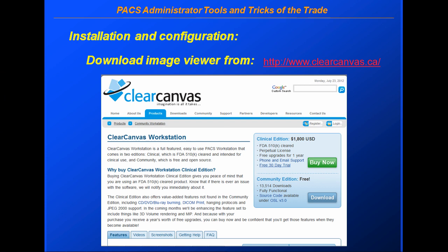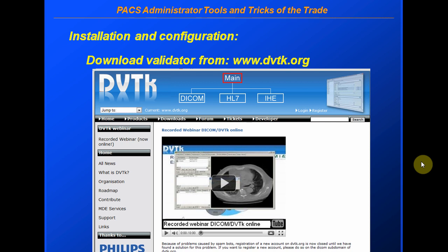The tool we're going to use for looking at the image header is called ClearCanvas. It's an open source product you can download from clearcanvas.ca — it's built in Canada, a very nice utility, and you can download the free version at no cost. The next tool we'll download is the DICOM validator itself, called DVTK — the DICOM Validation Toolkit — available from DVTK.org. You need to make sure you download not only the application but also the directory of definition files, which the validation checks against.